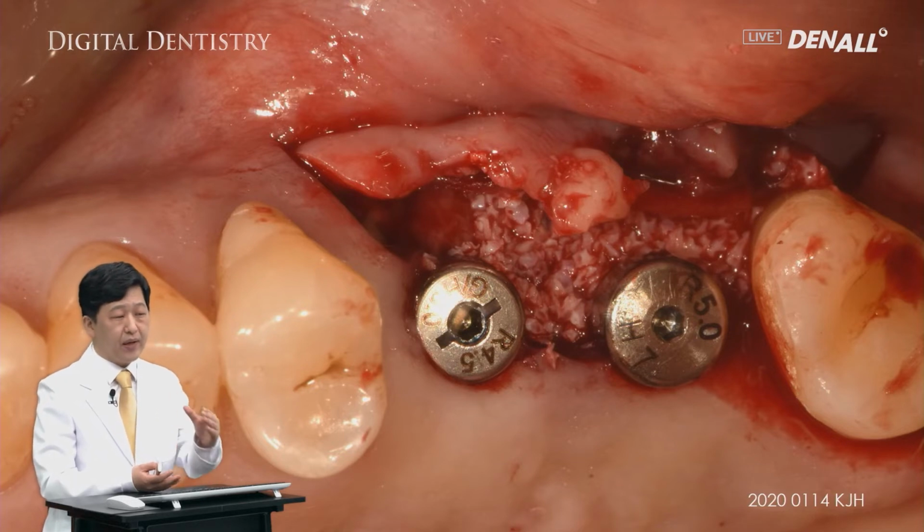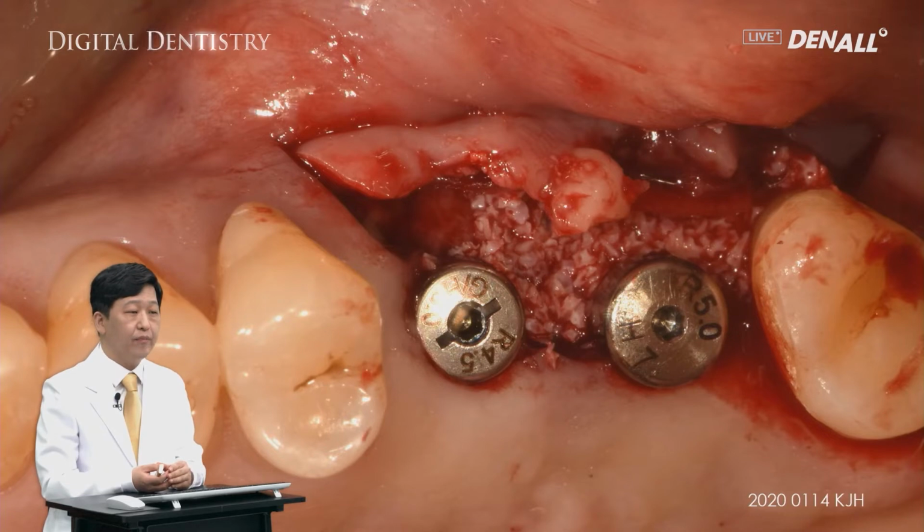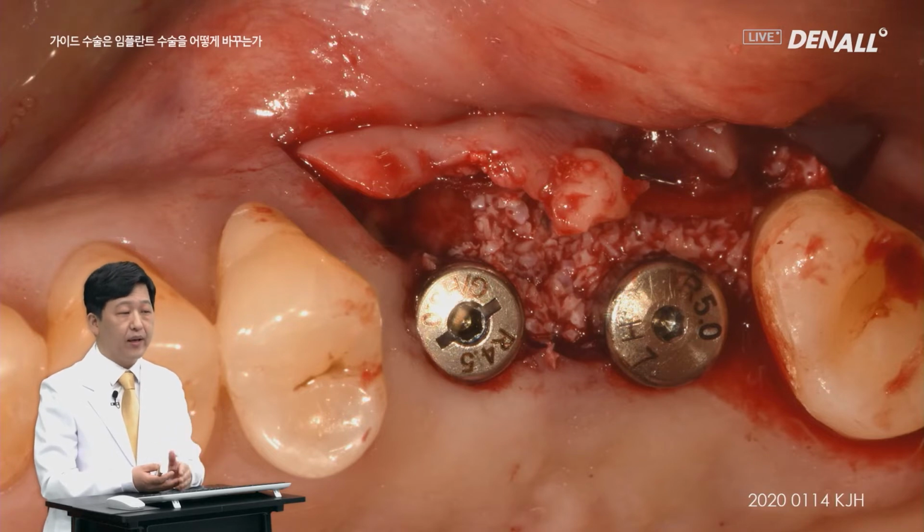Therefore, the implant may have been placed more buccally. However, in this case, guide was used and the implant was placed in ideal position, flap was reflected, and bone graft was done.